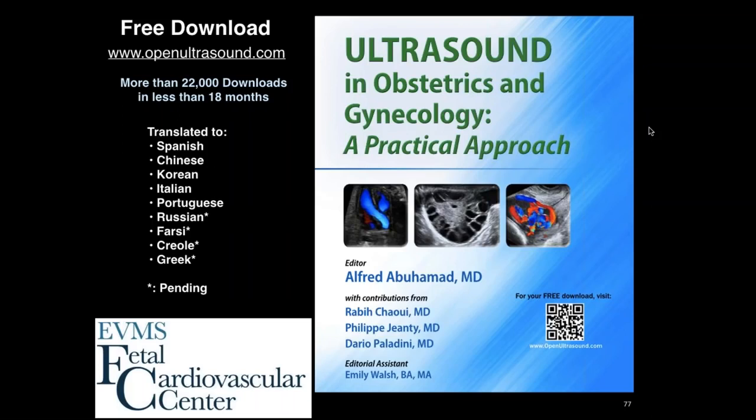What is the significance of the area behind the heart? The area behind the left atrium is really important. It's important because of the issue that I've discussed with the total anomalous venous return. And remember, this is where the esophagus also crosses, so you have to be cautious, make sure they don't mistake a dilated esophagus where the baby just swallowed with an abnormal vessel there. If you wait a little bit, the esophagus will close, and then you can tell that this was the esophagus you're looking at. Really important in detection of total anomalous venous return. Important detection of interrupted IVCs because the azygous vein would be dilated. Very important anatomic area to look at.